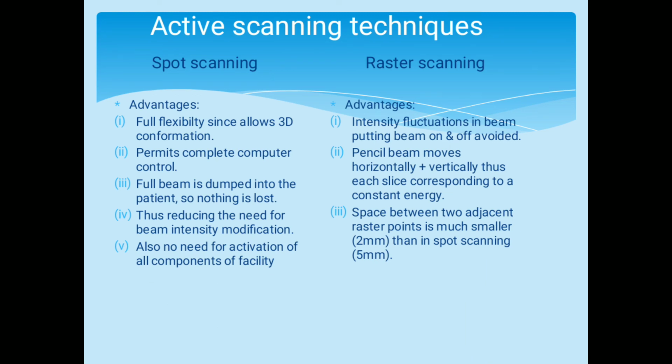Spot scanning advantages: full flexibility since it allows 3D conformation, permits complete computer control, and the full beam is dumped into the patient so nothing is lost, thus reducing the need for beam intensity modification. Also, there is no need for activation of all components of the facility.